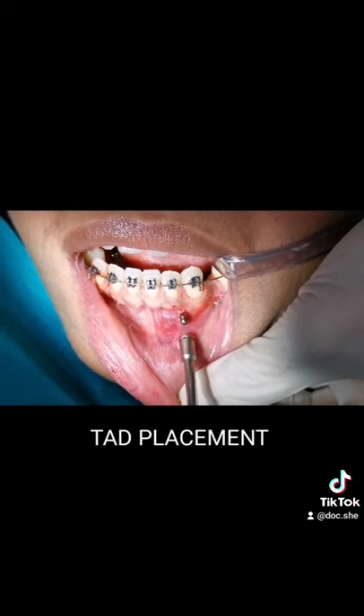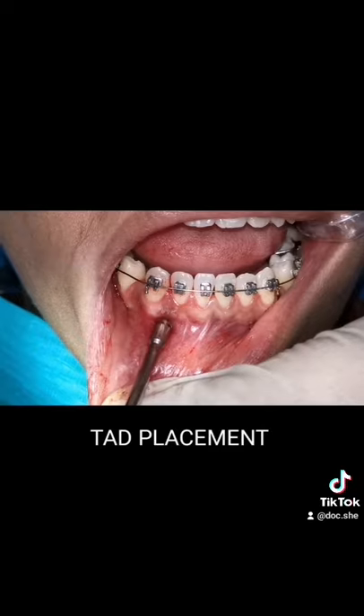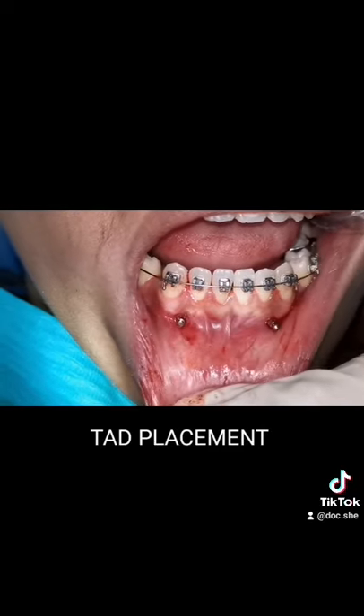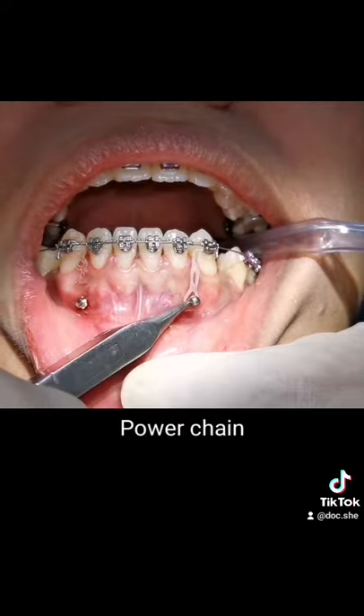I know what you're thinking, but trust me, it won't hurt. The procedure will be over in less than 5 minutes. To activate the tooth movement, power chains are placed and should be changed every month.